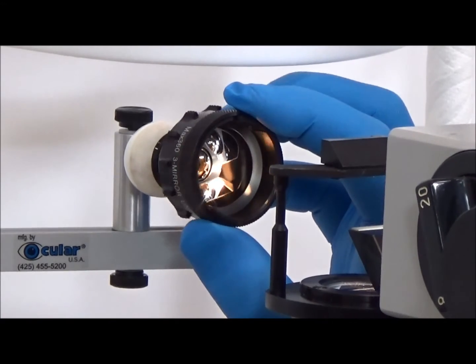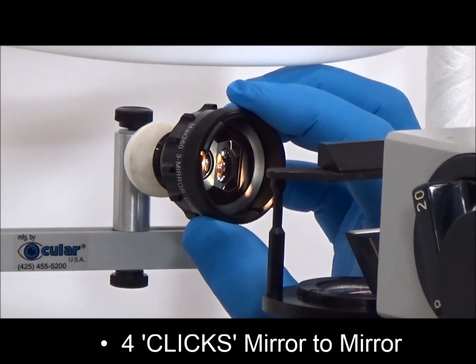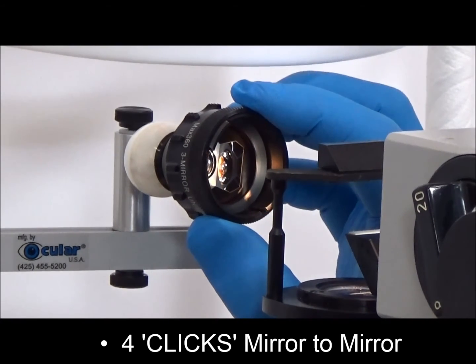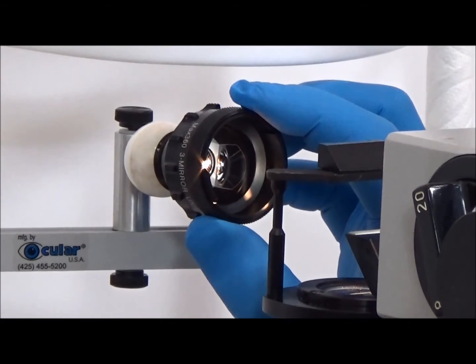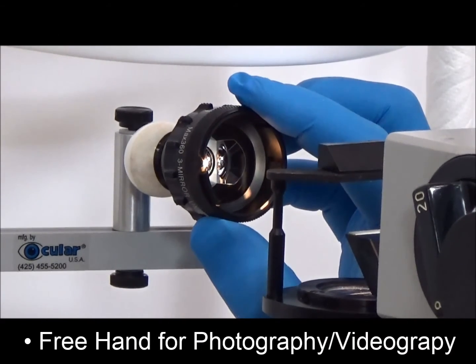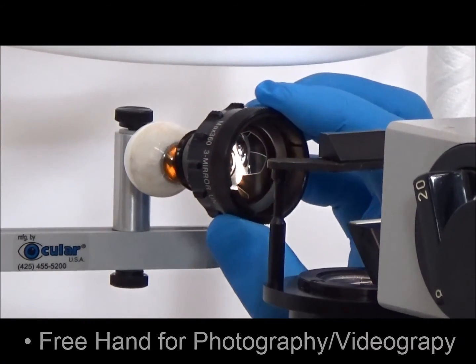For the three-mirror lens, changing from one mirror to another is also quick and accurate with the indexing feature. Just four clicks and you are confident a new mirror is viewing the same clock hour location. Manipulating the slit lamp for photography and videography is also easily accomplished, as your second hand is free to control these devices.